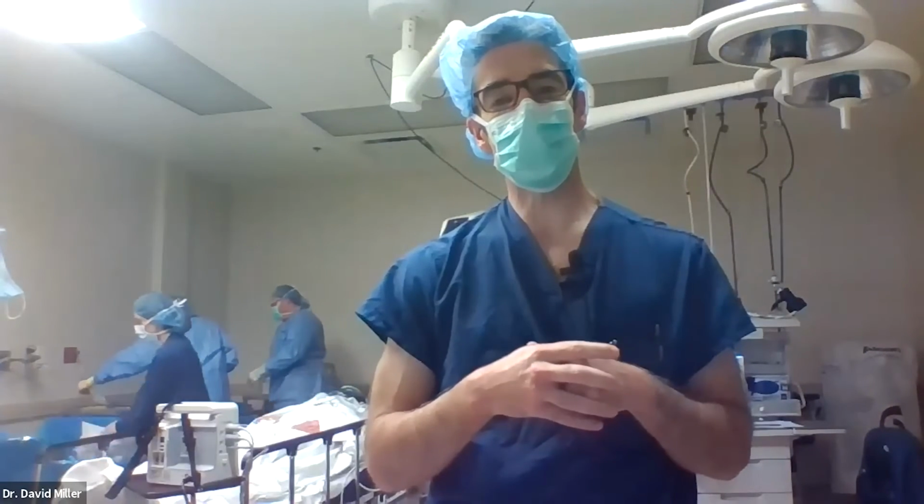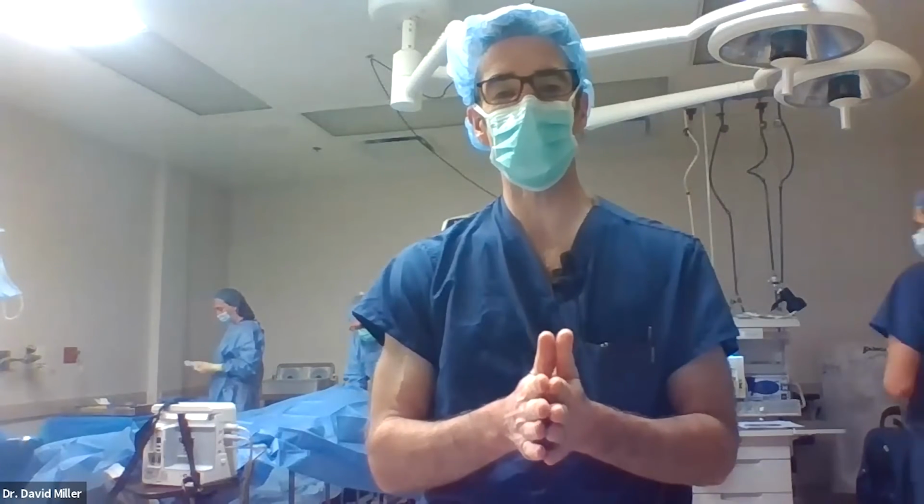And you always have some residual fluid that will track down into the macula, and you've got some risk of retinal folds, macular folds. You just want to be a little careful with that. And if you're starting out, I would highly advise posterior retinotomies. I know there's more nerve fiber layer down there, more condensed fibers. You may get a larger scotoma somewhere, perhaps.